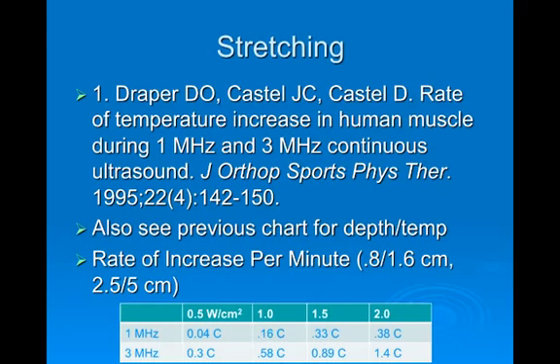on ultrasound. So here we have that same article that we looked at earlier in the table, but we're looking at it in the chart here. We're looking at what they found for the rate of increase for both 1 and 3 megahertz at various power settings: half, 1, 1.5, and 2. And so you can get just some idea of how quickly the temperature is going to increase.